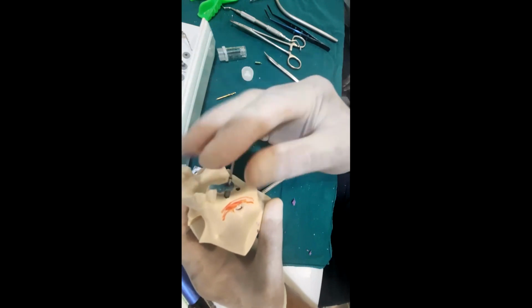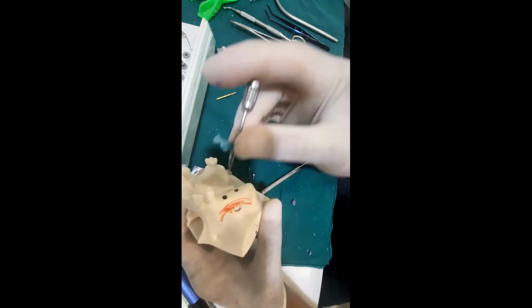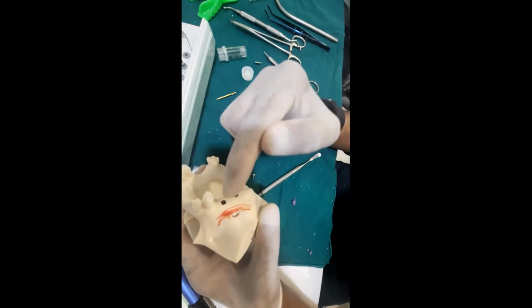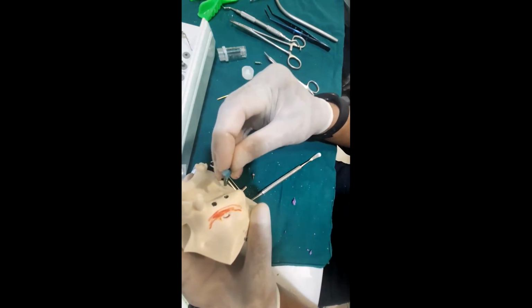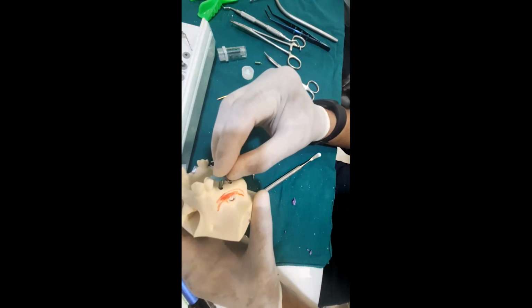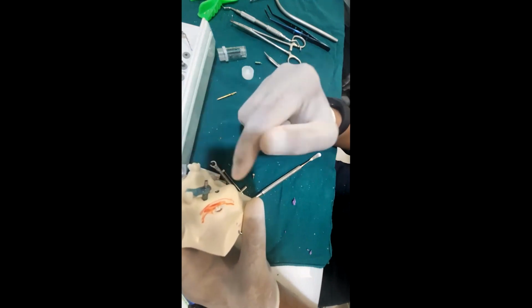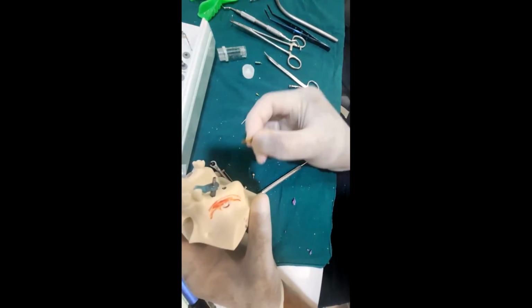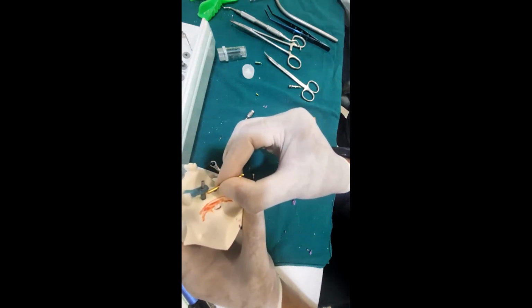And if you have, suppose, multiple implants, then as I said, you can use floss ties to tie the impression copings together to make a framework over which you will have your jig material flow to ensure that it becomes rigid. A lot of doctors also use burrs to stabilize the splint.